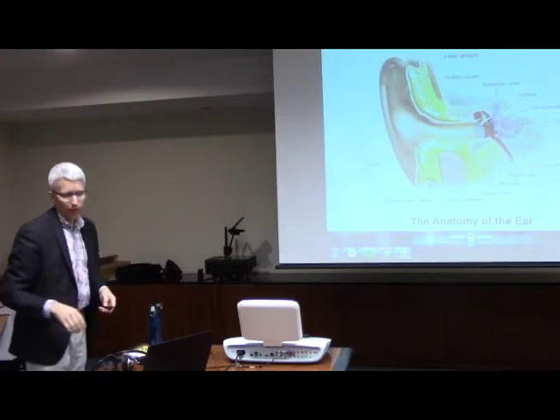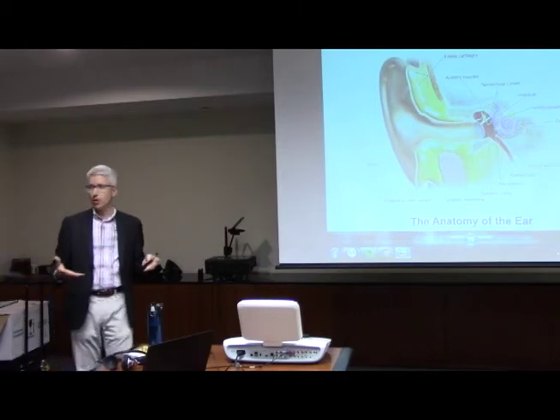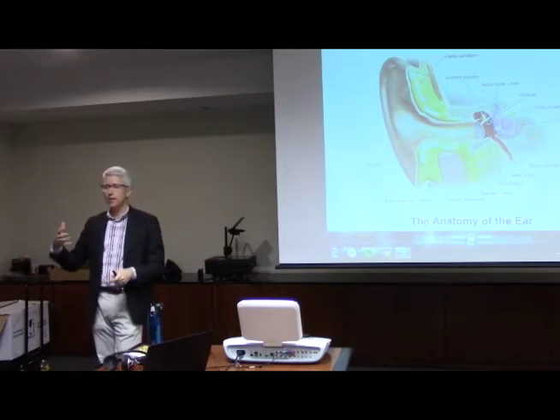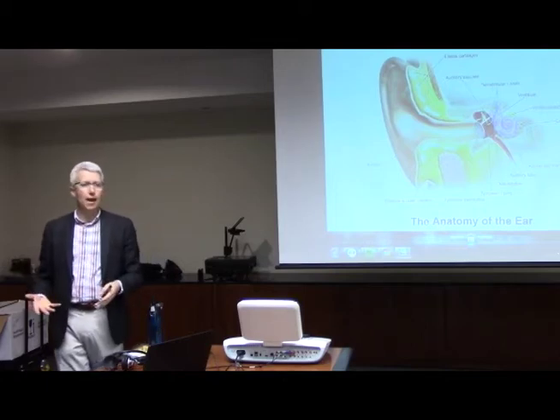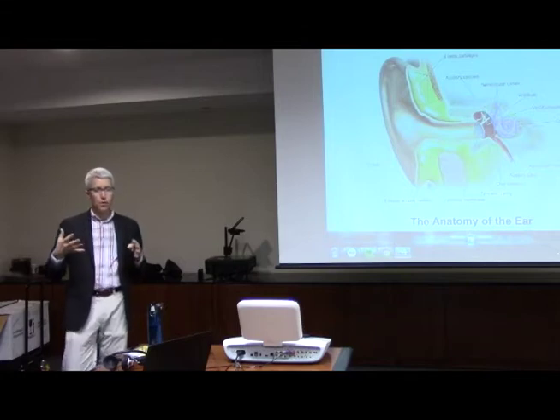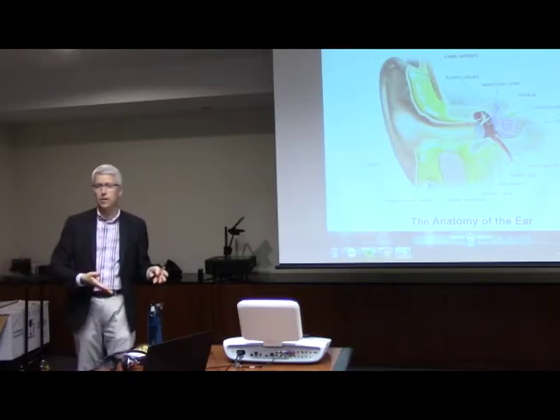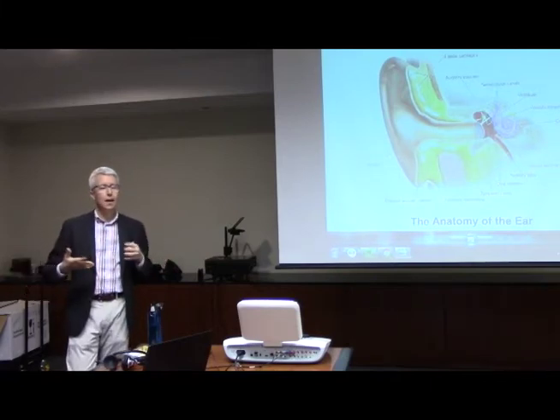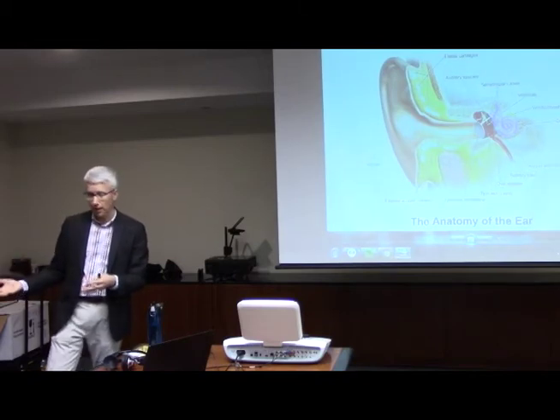Now, this is kind of a comprehensive hearing test. So when this is done, the audiologist or the person doing the testing is going to know the type of hearing loss, the degree of hearing loss, and how much it's impacting their ability to understand speech. And usually for medical purposes, they'll be able to share this with the physician so that the patient gets treated, or they can make some decisions about amplification, such as hearing aids. Really significant hearing loss can mean cochlear implants, that kind of thing.